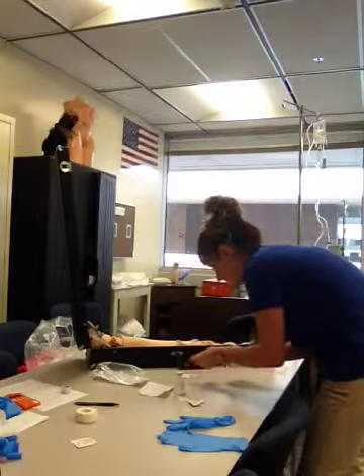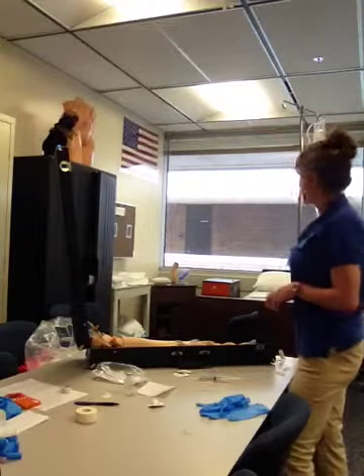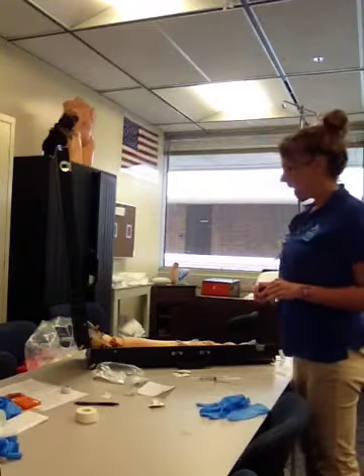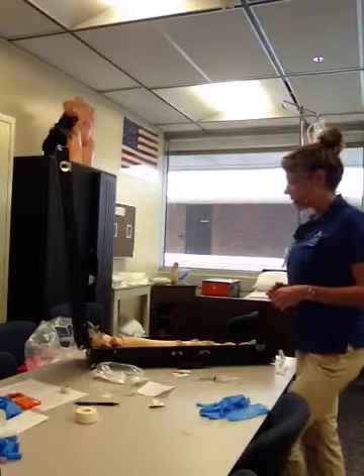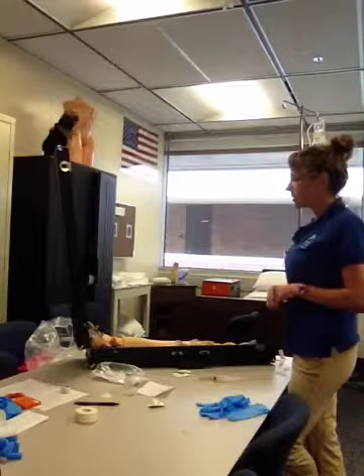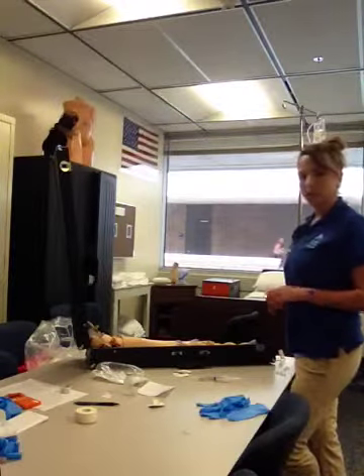Okay, and I'm going to go into the patient's room and introduce myself. Hi, I'm Katie. I'll be your nurse, and I'm going to be infusing some antibiotics for you in your IV line. I'm going to ask Mrs. White to please state her name and her date of birth to verify the patient. And I'm going to reassess the patient for any allergies, ask her if she has any allergies, especially penicillin or hypersensitivity to cephalosporins or penicillin. And the patient states that she does not.